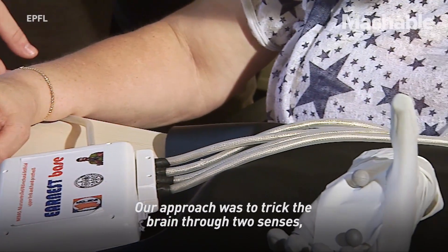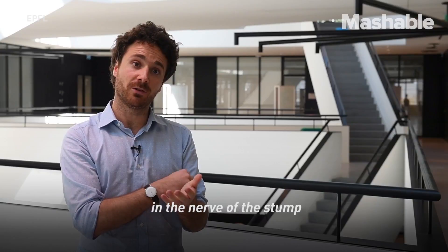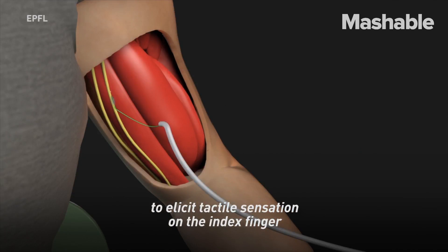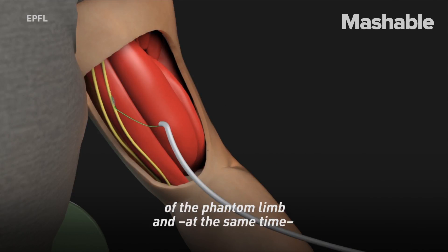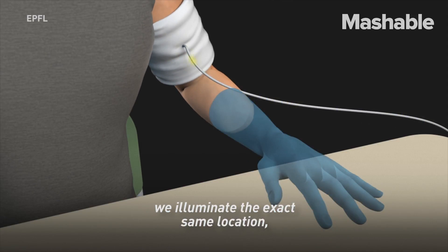Our approach was to trick the brain through two senses: vision and touch. We administered neuro-stimulation in the nerve of the stump to elicit tactile sensation on the index finger of the phantom limb, and at the same time, we illuminate the exact same location — the index finger of the prosthetic device.